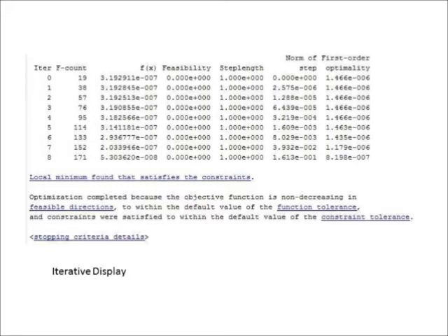When the optimization is run, we look for cases where the function value would decrease, which would correspond to an approaching minimum, and an indication that the next guess has resulted in progress towards the accurate solution. When the guess is stuck in a local minimum, it is hard to make progress as the next guess might result in an increasing function value instead of a decreasing value.